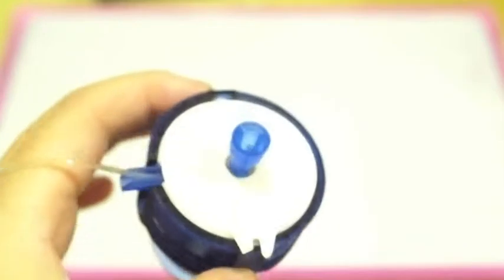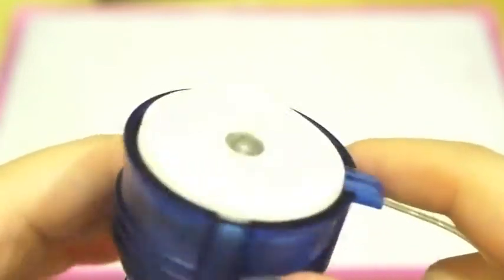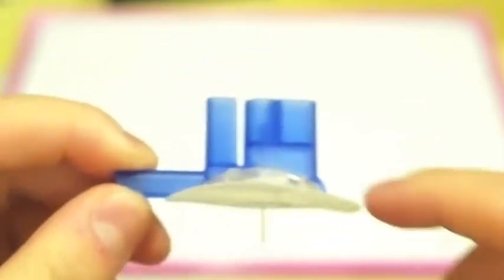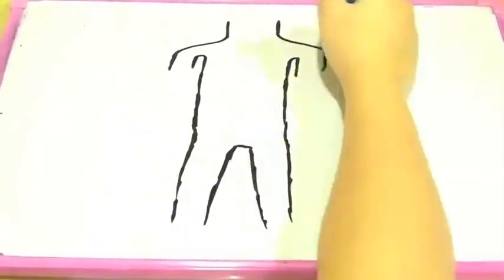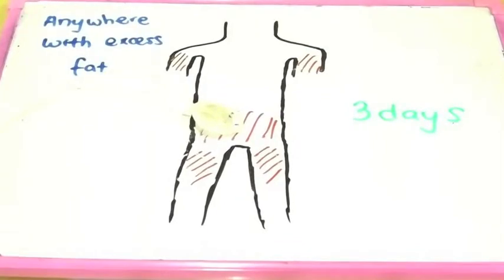How the insulin pump works is that the cannula from the infusion set will be inserted into the infusion sites or areas using the small needle and the quickserter sticking to the skin with a plaster. The needle will be removed after the infusion set has been inserted into the body, leaving the cannula inside the body to deliver insulin.